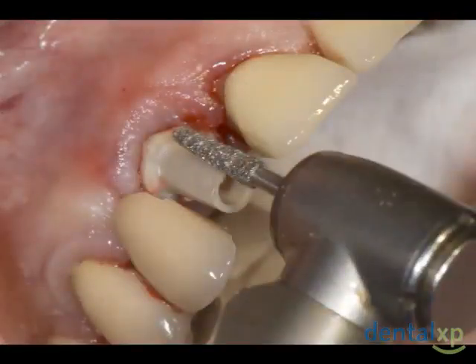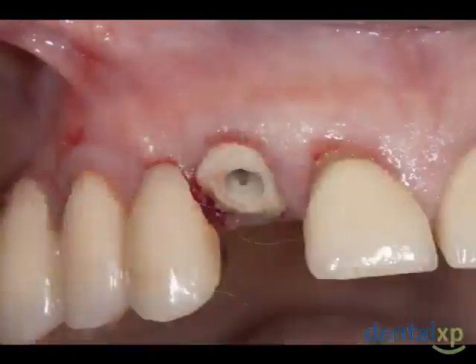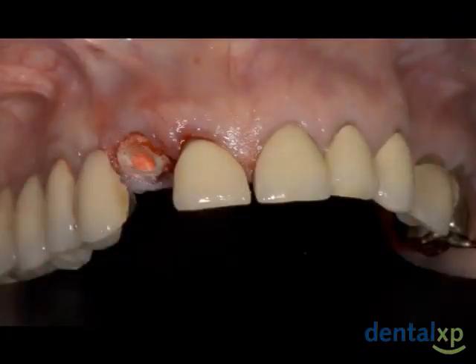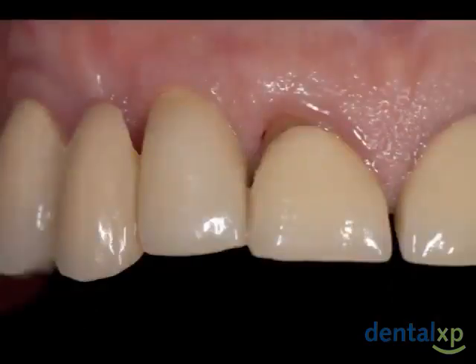Now a contoured healing abutment designed for the emergence profile of a lateral incisor is screw retained to the implant and modified to develop the proper tissue height. The abutment is then reduced to the gingival height. Gutta percha is placed in the access hole. And after healing, a final restoration is fabricated to the proper emergence profile.